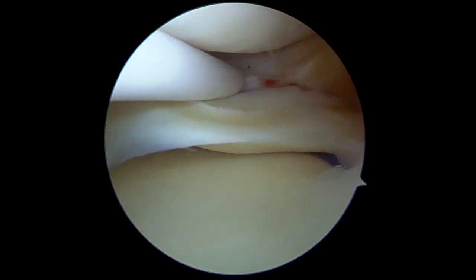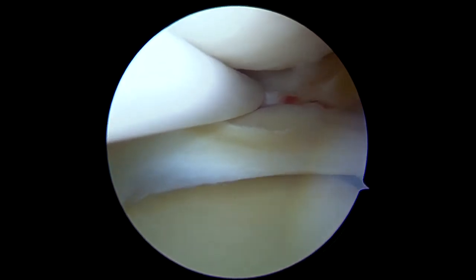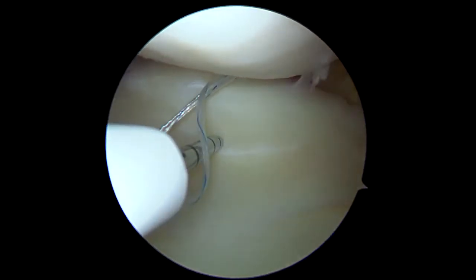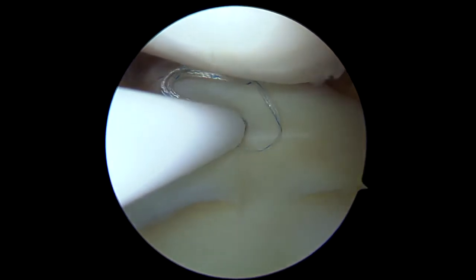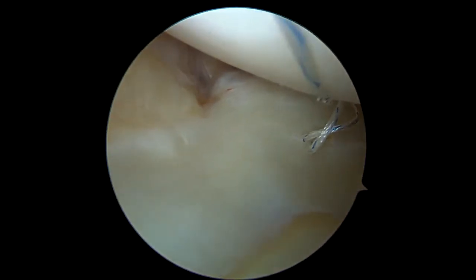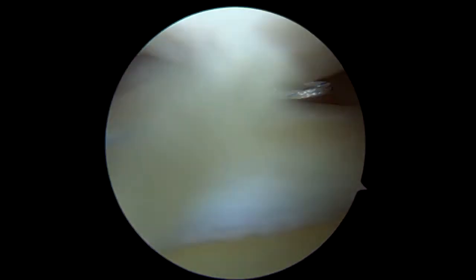All repair procedures were done with the FASFIX 360 meniscal repair system, introduced through the anteromedial portal over a slotted cannula to avoid lodging of soft tissues. The first needle is fired at the posterior capsule, and the second one is fired on the meniscus body. The suture is then tightened, and we observe that the gap made by the ramp lesion is approximated.